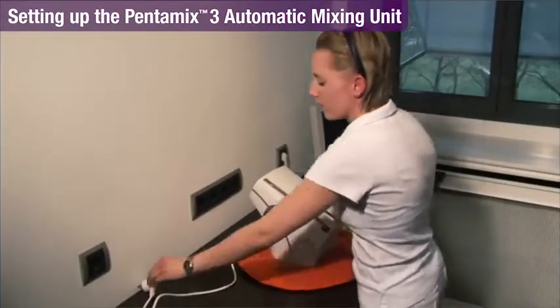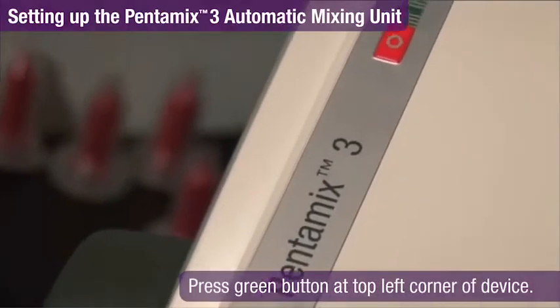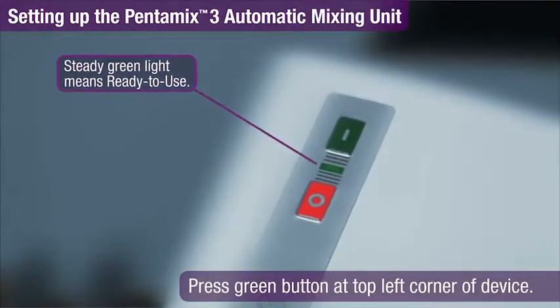Plug it into a grounded electrical socket and turn the unit on. After blinking for a few seconds, the LED's steady green light indicates the unit is ready for operation.